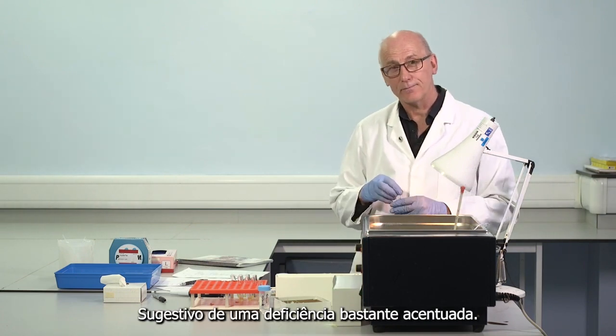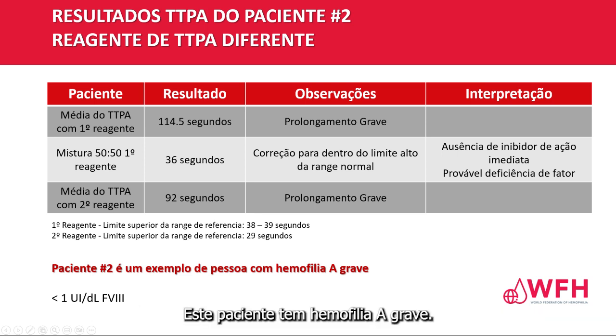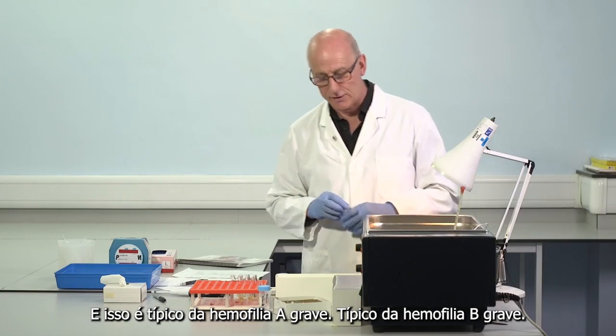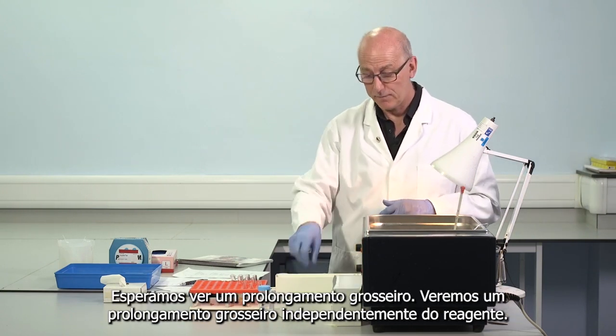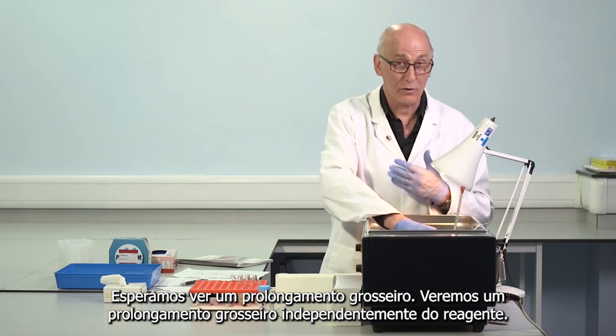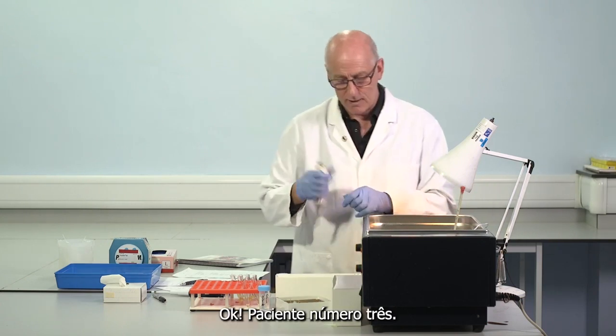Grossly prolonged with both reagents. Suggestive of a pretty marked deficiency. Very good correction, also suggestive of a marked deficiency. This patient has severe haemophilia A. Complete absence, less than 1 international unit per deciliter factor VIII. Essentially no factor VIII. Still clots, I think you know this, but it's a gross prolongation with both reagents. Not the same time, but a gross prolongation. And so that's typical of severe haemophilia A, typical of severe haemophilia B. We expect to see gross prolongation irrespective of reagent. Not the same numbers, that depends on the reagent.